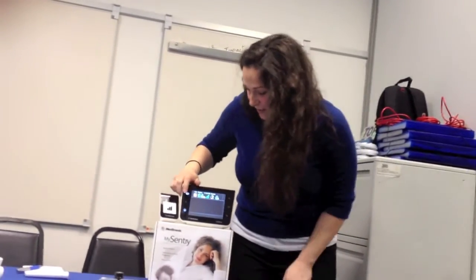Yeah. Or if you don't want to drive yourself crazy by laying there and staring at it. I've read on the blogs that sometimes people stare, it's stalking the CGM. You just stare all night because you're so fascinated and so interested to see it. It's definitely interesting as well. It's a good idea. A sleep mechanism. There you go.